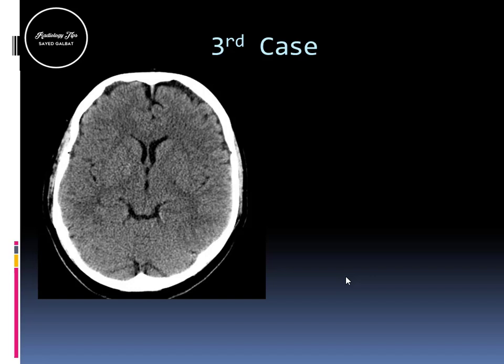Here, on this side? This one, the left side. You may agree, you may not, right? Okay, I may agree, I may not. But still, it's not conclusive.